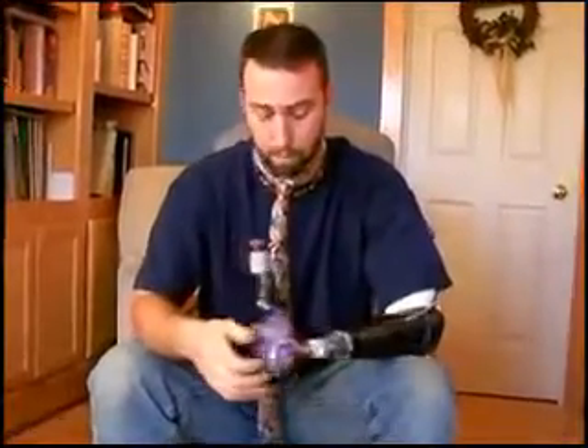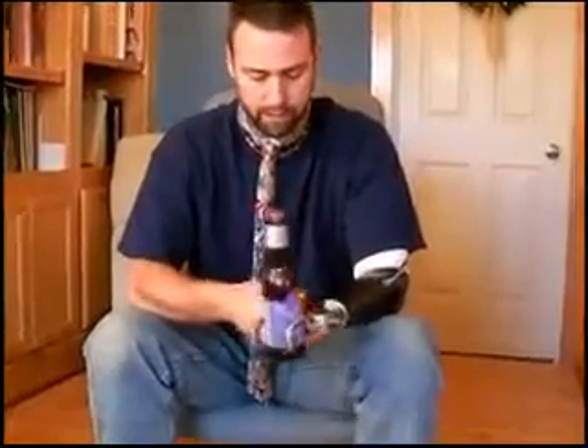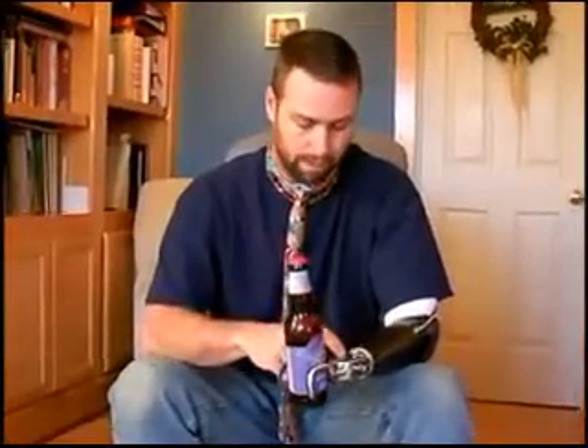That kind of brings us to the whole problem with the cast version of the APRL. The twisting motion is what kills this device. Having it locked in position and applying a force can make these parts break. Maybe technology is getting better on the casting, but I'm not sure that it really is. The ones I had been getting refurbished over and over again for three or four years definitely fail over time. This one happens to be actually brand new.